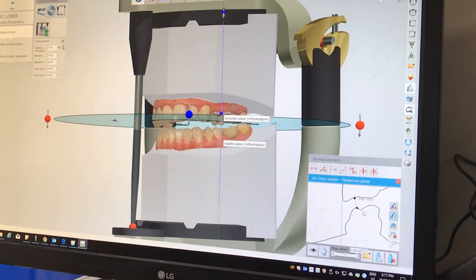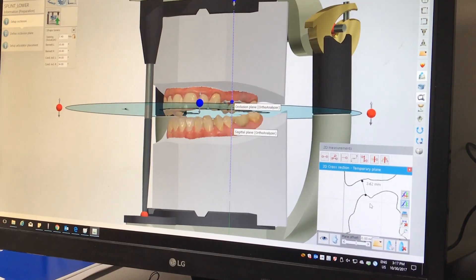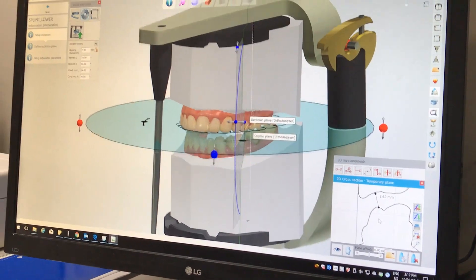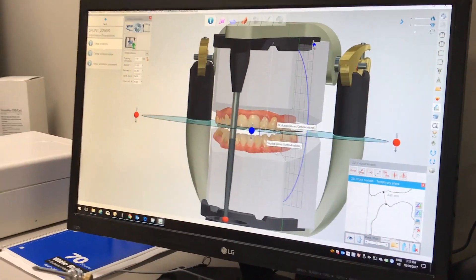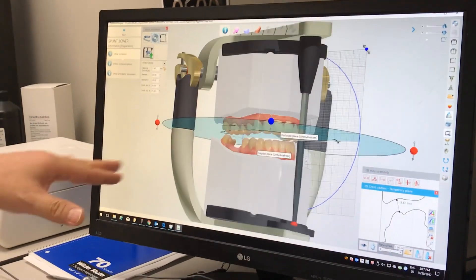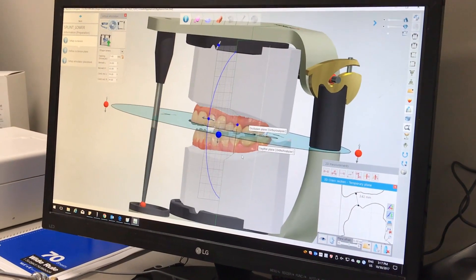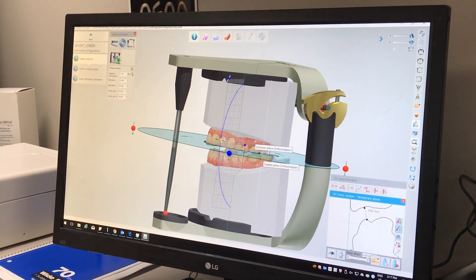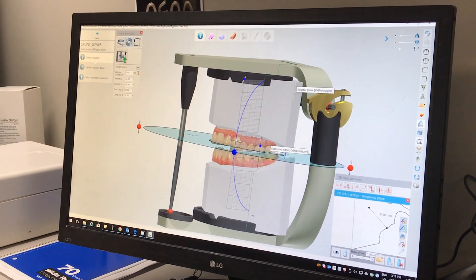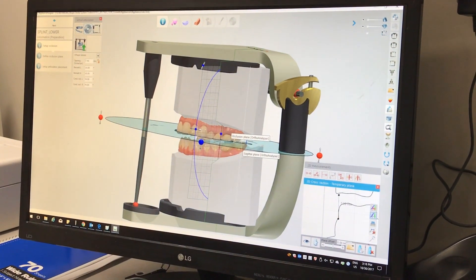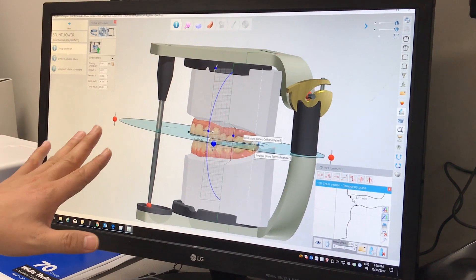Here briefly I can show you the occlusion in more details — 3D measurements. You see the indicated 3.62 mm, exactly what the doctor requested. Then the occlusion plane — I set the sagittal plane as well as the four guidelines. See this — we checked that one too. That's its beauty.